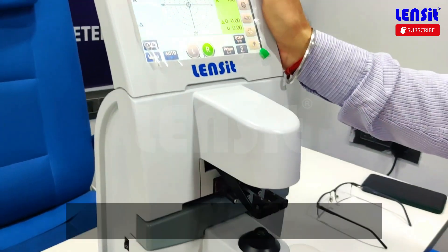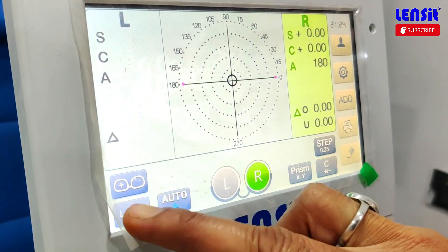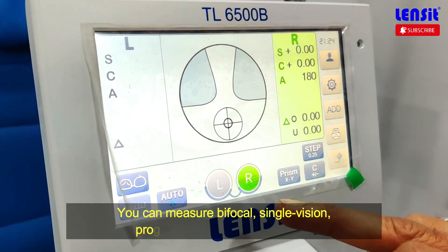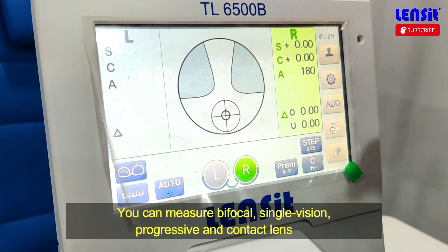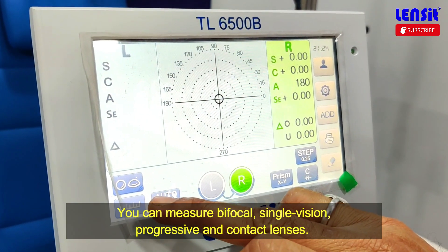First of all, you have 3 modes. This is single vision — this is a plus sign. This is bifocal and progressive. This is the same mode. This is the contact lens mode — you can measure the contact lens.